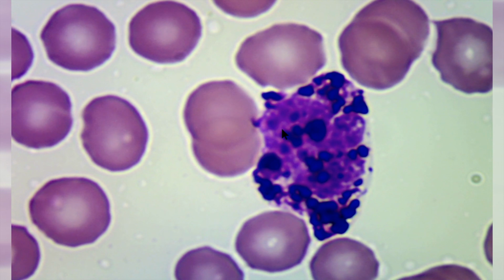However, the appearance is quite distinct. So this is a basophil with large, dark, black granules that are very unique to basophils, and you don't see that in any other cell to this extent. Another cell that may have this appearance is the mast cell, but mast cells are usually found in the tissue rather than in the circulation.